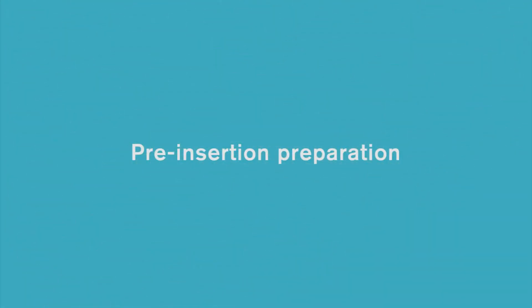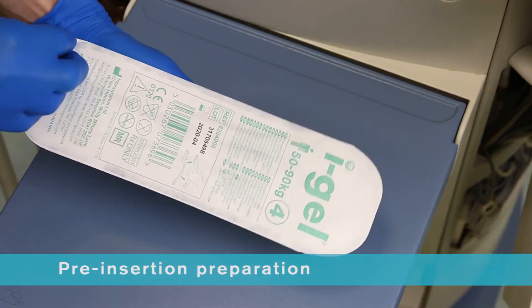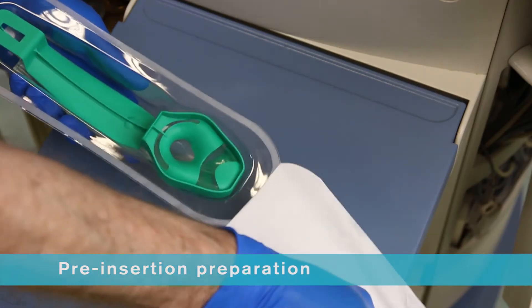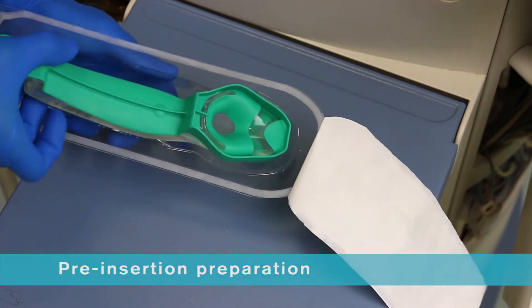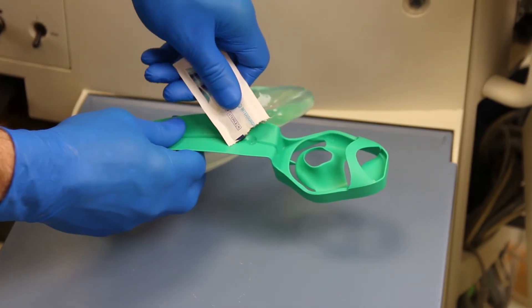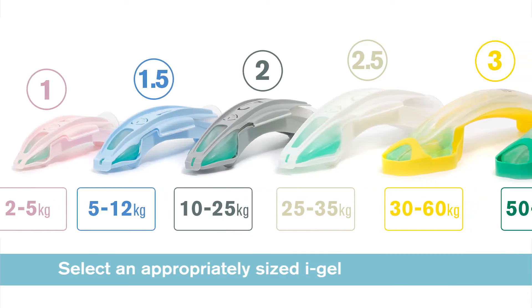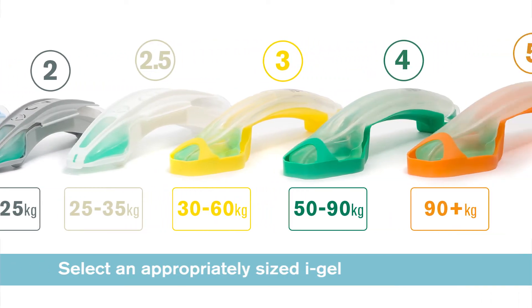Pre-insertion preparation: iGel is supplied in a sterile pouch enclosed in either a protective cradle or a cage pack. This innovative packaging is colour-coded for size and designed to ensure the device is maintained in the correct flexion prior to use. It also acts as a base for lubrication. Select the appropriate size iGel according to patient weight.